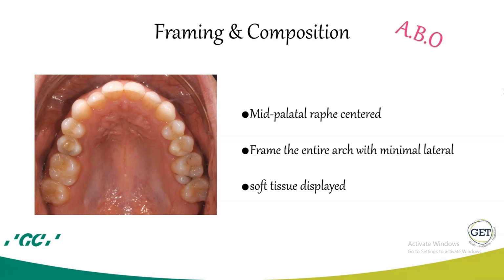Occlusal photographs. The mid-palatal suture or raphe should be centered. We should frame the entire arch with minimal lateral soft tissue displayed. In occlusal photographs, our lip retractors are very important.